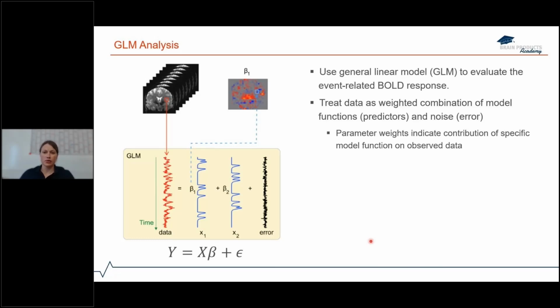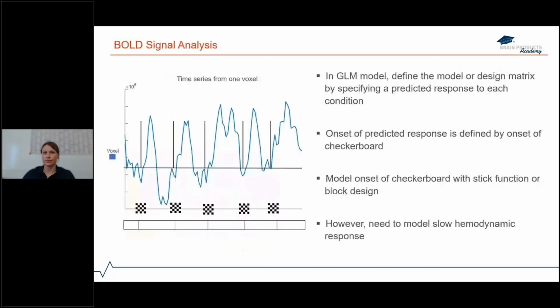And the shape of the fMRI signal is known as it is determined by the onset of our experimental condition, but the expected amplitude of a response is not known, and this is what we will now estimate. Note that the GLM is performed independently for each voxel, and we will now focus on how we can create one of these predictors of interest.